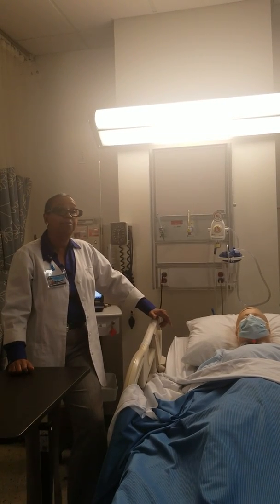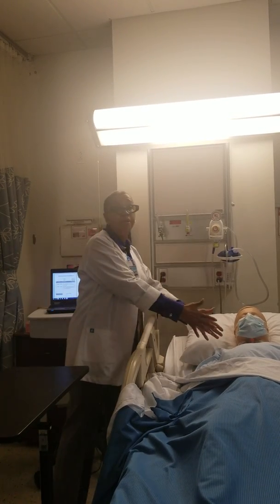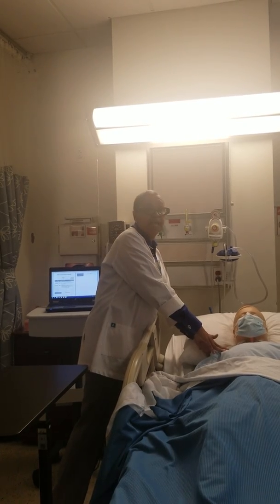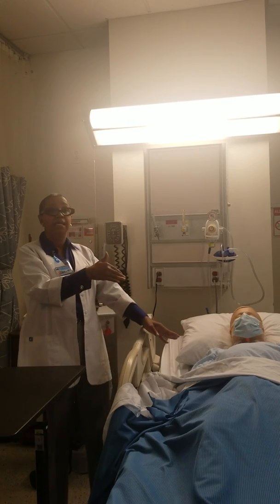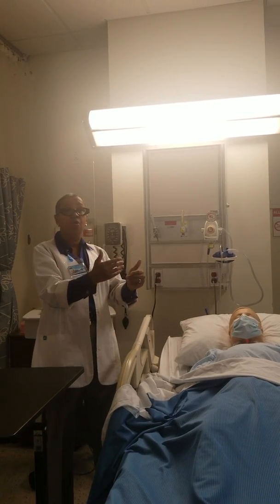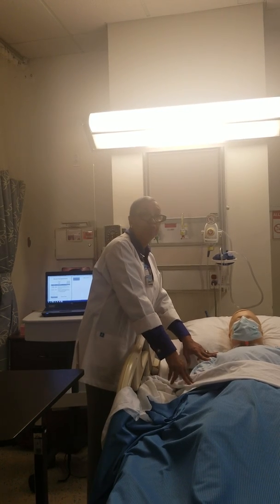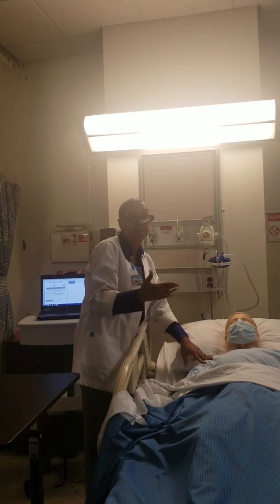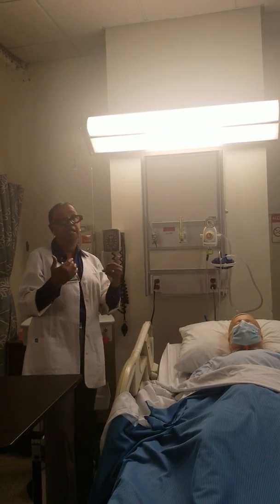Okay, I can't reposition that. I have to call a healthcare provider to reposition this and tell me it's too low according to his x-ray, because they'll put this in at the bedside, tell you to shoot an x-ray, you find out that it's too low, you have to call that person back and say my x-ray is not where it should be. If it's a PIC, and a lot of times nurses do PICs and they're PIC certified, when they get an x-ray or sonogram and they know it's not sitting there, they'll come back and reposition. Us as RNs, we just can't reposition.